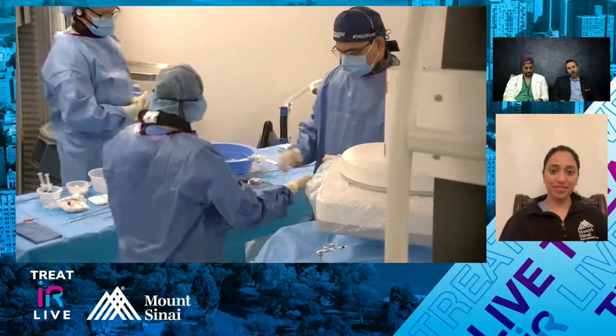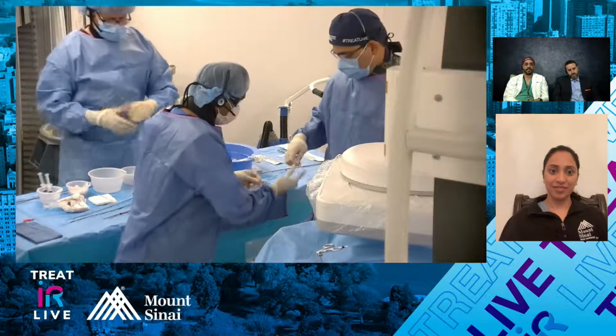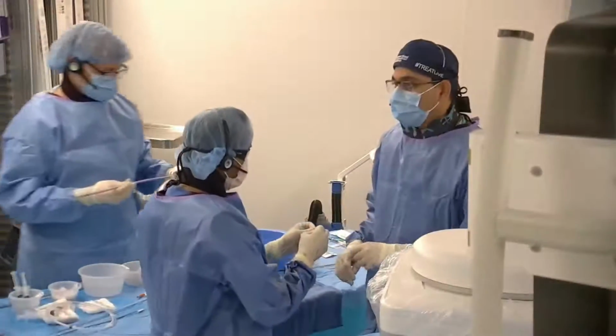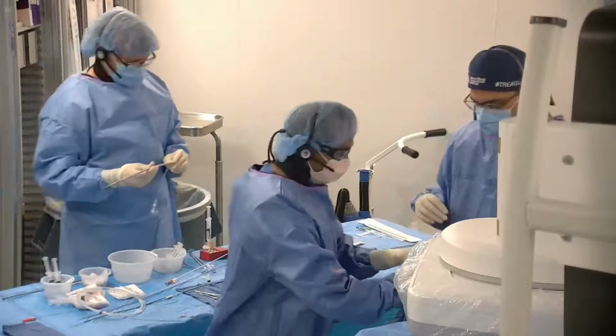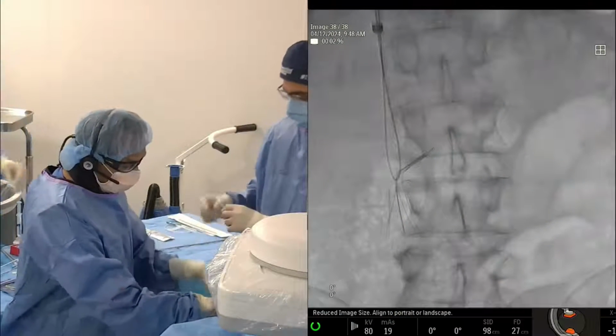Yeah. So Raj, you said you're going to go up to the 18 40. Yeah, exactly. The wire is a little bit trapped in the filter, so we're going to need to disengage it a little bit. We're just going to get a catheter down because it doesn't want to slide off so easily. The loop, I think, is just.